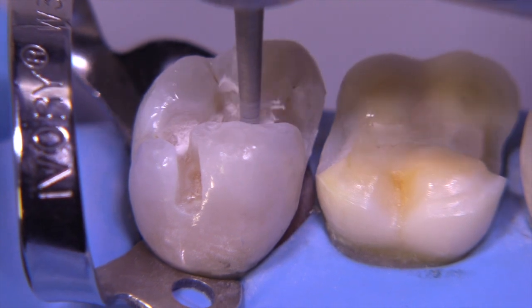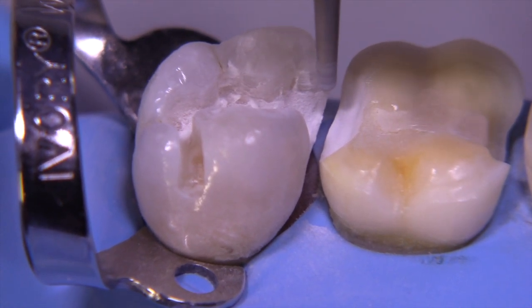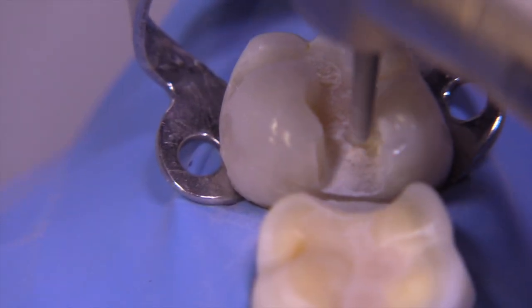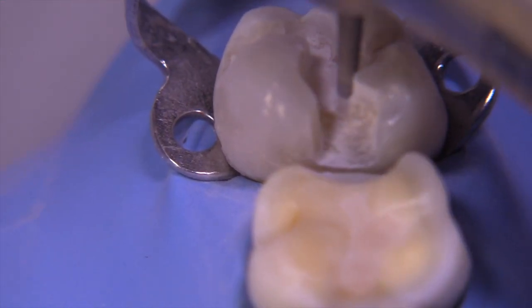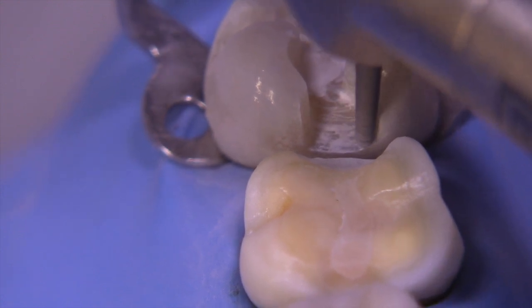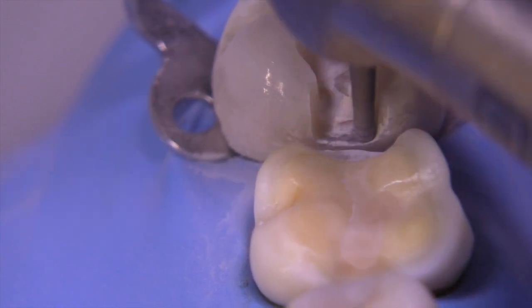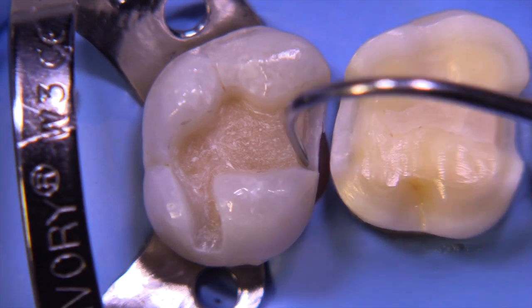Now we're ready to refine the preparation using the 847 KR 016 — it has a flat end with slightly rounded corners. The 847 without the KR designation has a sharper edge at the base. I like the 847 KR; it's really made for ceramic preparations. We let the burr help create the taper, and also tip the burr as necessary to achieve adequate taper throughout. We're also widening the box to establish a nice interproximal contour, since we're correcting a diastema between the second and first molar with these two restorations.